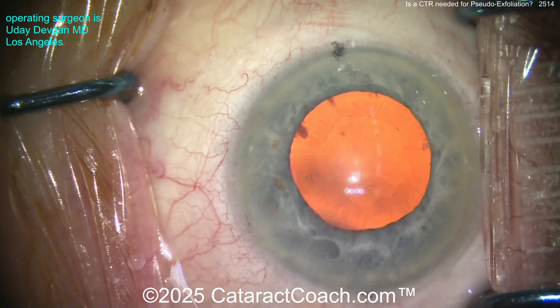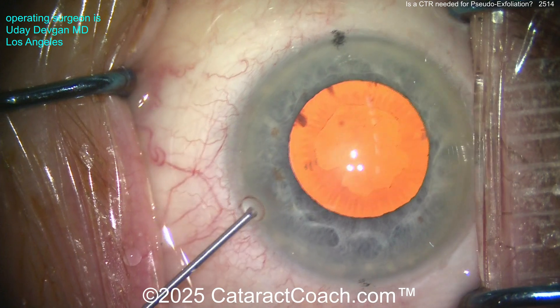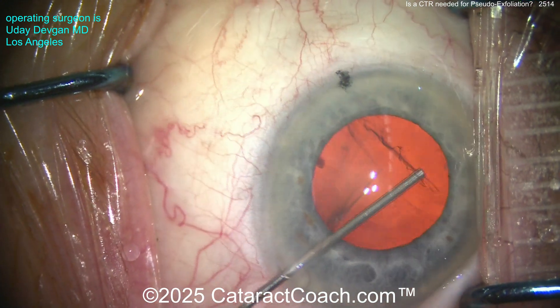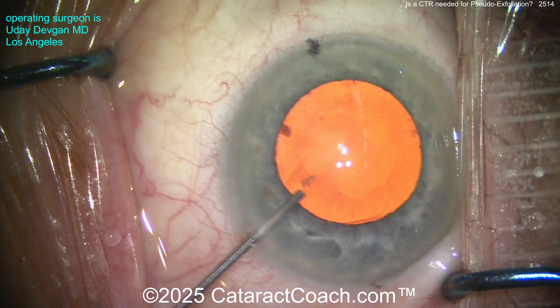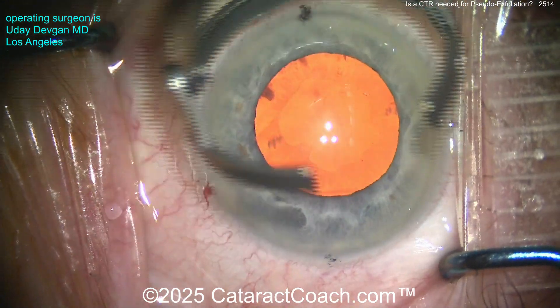We're putting in some intracameral phenylephrine — maybe we can get a little bit more pupil enlargement. Here comes the viscoelastic. We're going to do an injection here, but also Osher's technique — a little viscomydriasis — where you inject the viscoelastic and push at the pupil margin to get a little bit more temporary mydriasis.